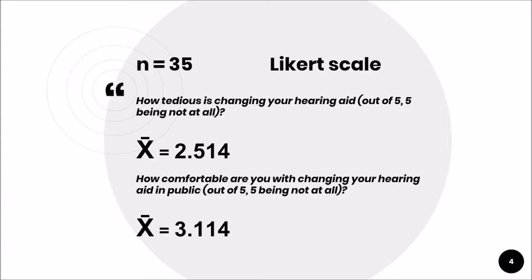In a survey with a sample size of 35 hearing impaired people, the participants were asked, how tedious is changing your hearing aid? The scale being a Likert scale out of 5, with 5 being not at all. The participants rated their annoyance to be approximately half, showing that while hearing aids are not a hassle, they could be more efficient. In a follow-up question, the participants were asked, how comfortable are you with changing your hearing aid in public, using the same scale? The participants on average rated their comfort levels around 3.114, leaning more towards the side of being uncomfortable and embarrassing to constantly readjust their hearing aids in public.